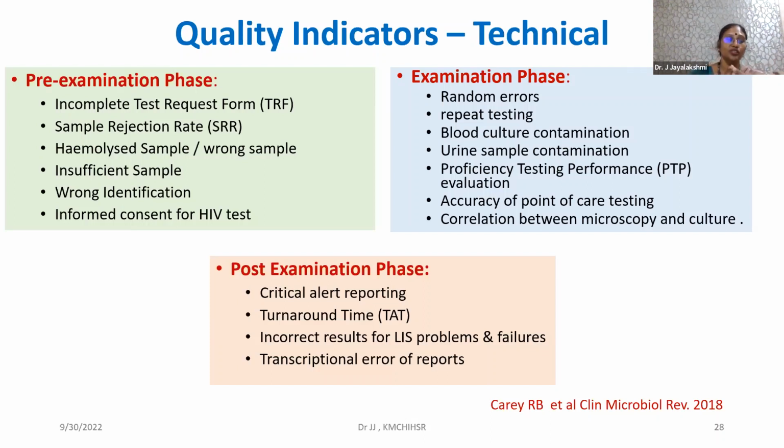It's a good thing to capture the whole so that you see multiple other variables also and address them, or you just focus on your lab and start working on it. If it's a standalone lab, it becomes easier that way, or look at what more can be captured in this. Remember and look very critically whether you are capturing the collection time, the receiving time, the reporting time, and the release time. Is this capture being right in its way of communicating in the turnaround time that you do?